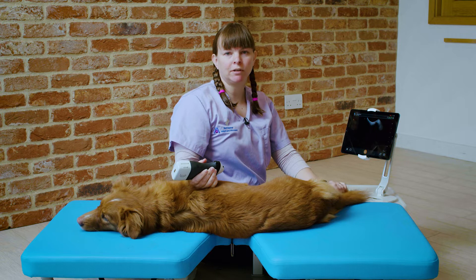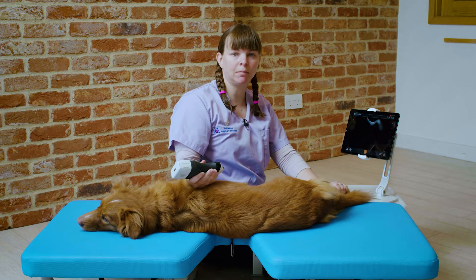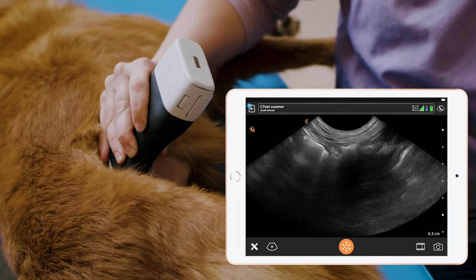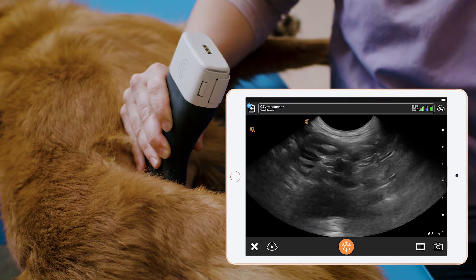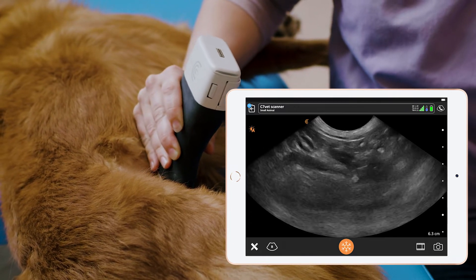So now we've turned Pippi over into left lateral recumbency and we're going to look for the right limb of the pancreas. We start up near the right kidney and we bring the probe ventrally down the abdomen. We're looking for the duodenum, which is the first loop of small intestine that we come across.